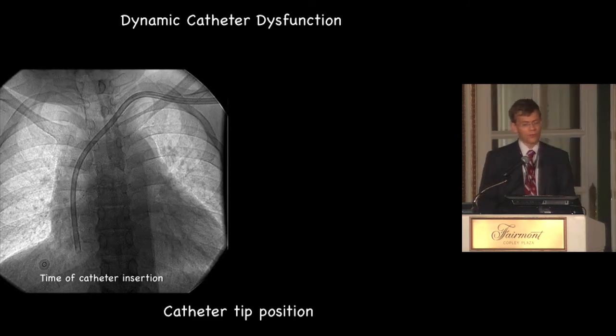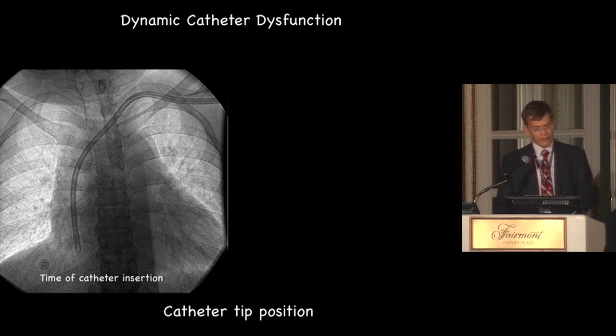There's a different kind of dynamic catheter dysfunction that is related to the tip position.